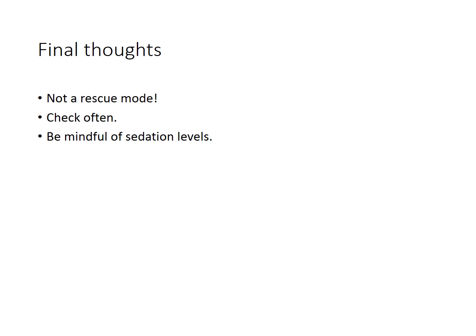It's important to check this often. Our guideline right now is just recommended every 3 hours. However, just be mindful of these kinds of patients. Stick your head in. You don't need a full check every single time, but know what your waveform should and should not look like, and check in with your nurse, making sure that they're comfortable with the patient being on this mode and answering any questions that they might have.